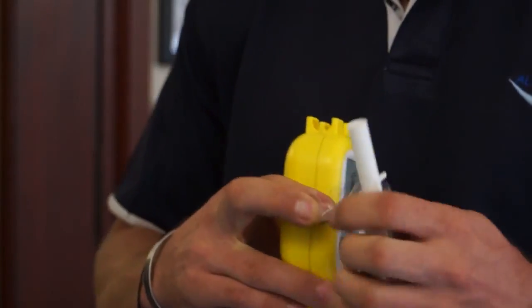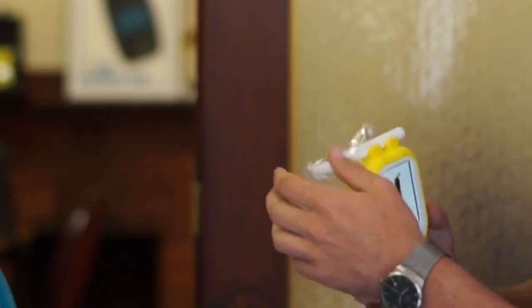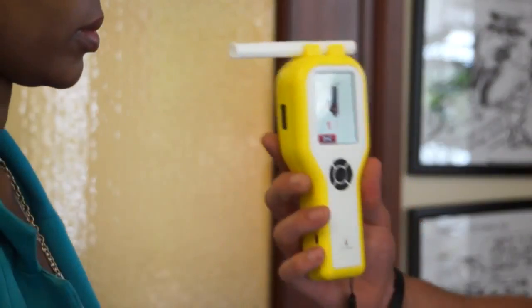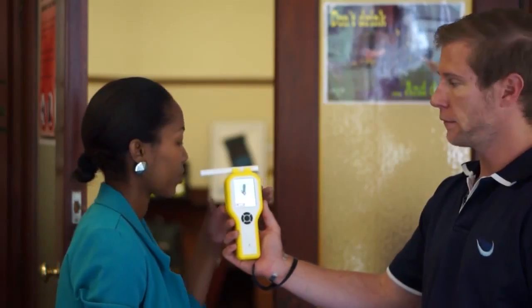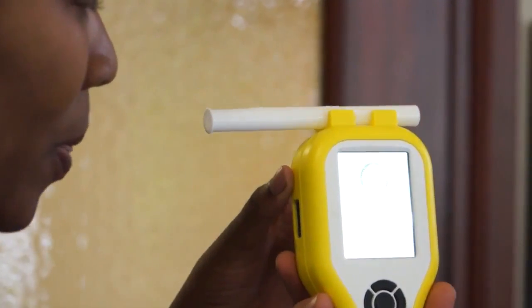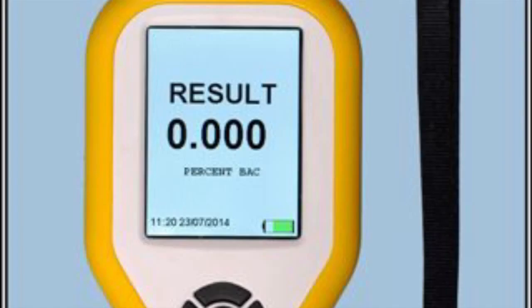Now I have to fit a mouthpiece, so we'll just open the mouthpiece — it must be sealed. And then blow through as long as they can. It then says analyzing, and it gives us the result as zero.